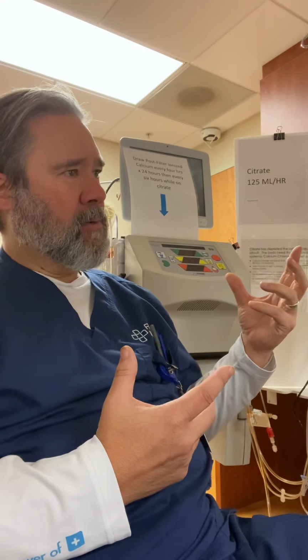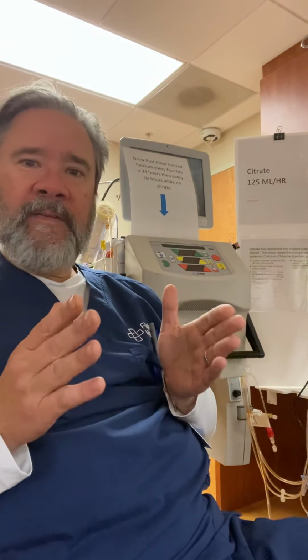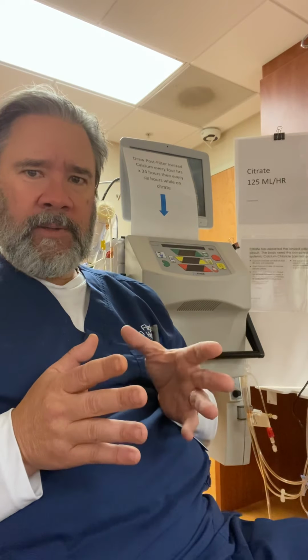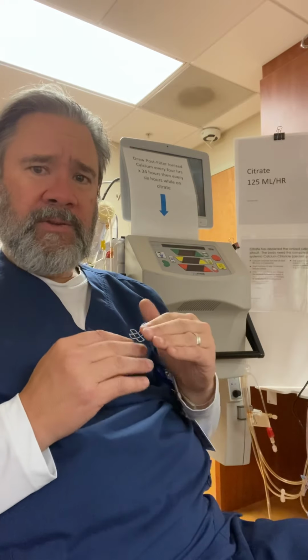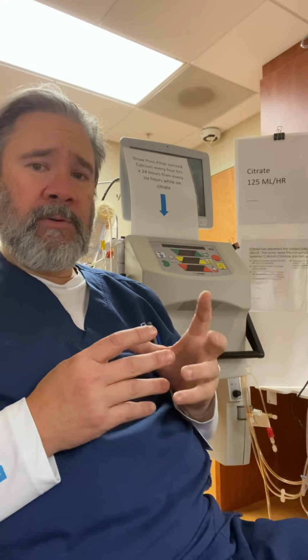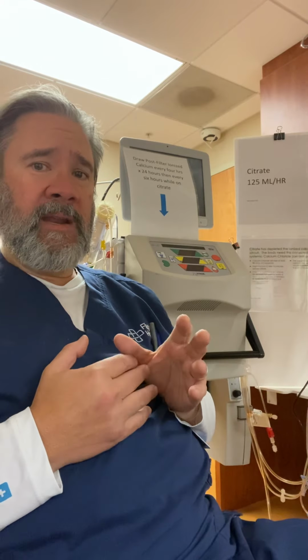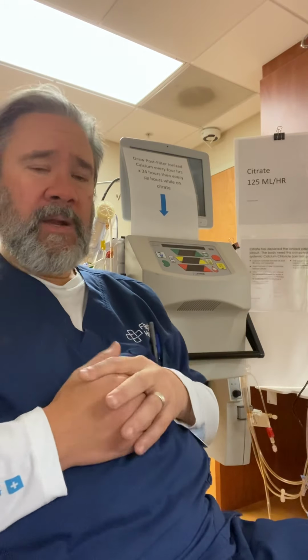So calcium chloride is ordered based on millimoles, factored by the physician and pharmacy. They'll decide how many millimoles they'll need, but the starting range is 55 to 88 milliliters an hour. You'll have a titration order. So if it's low, you'll be able to give boluses of calcium chloride, and if your calcium is high, we're going to decrease the drip.